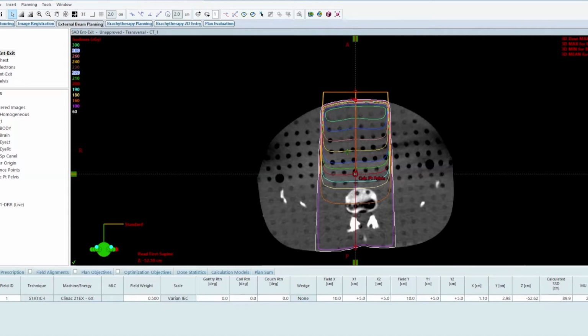As the dose falls off and goes deeper into the patient, the percent depth dose has an inverse square component in it. So that's why you don't need to do a separate inverse square component as part of the calculation unless you're at a different SSD than the calibrated SSD.